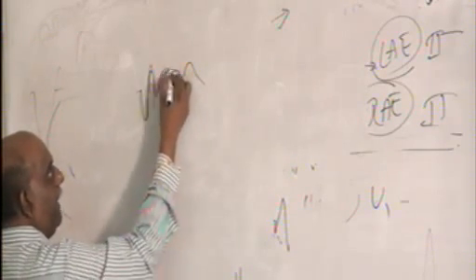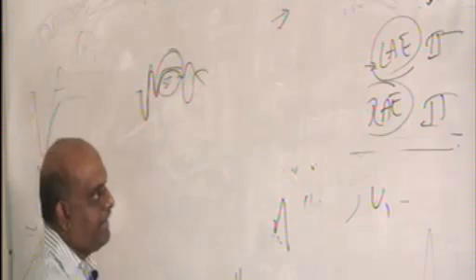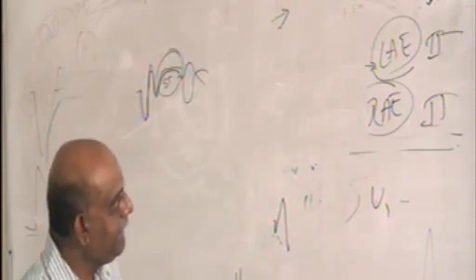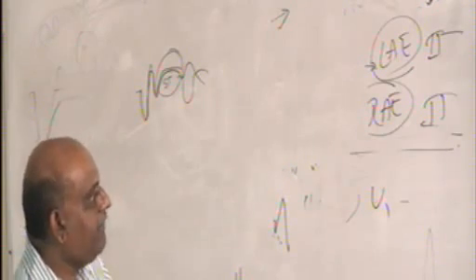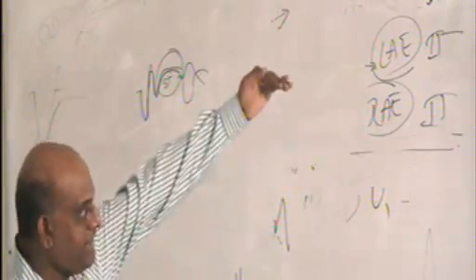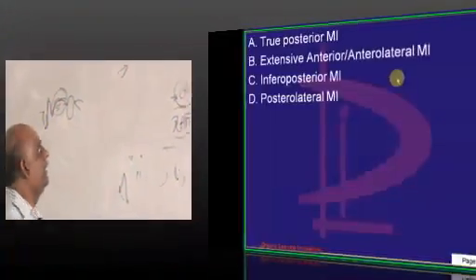So Q wave and ST segment elevation and T wave is appearing. T wave also should be inverted. Is it inverted? The T wave is not visible, there is flattening of T wave. Where? In AVL. But ST segment is elevated, Q wave is there before R. So that's how it's an anterolateral wall MI.